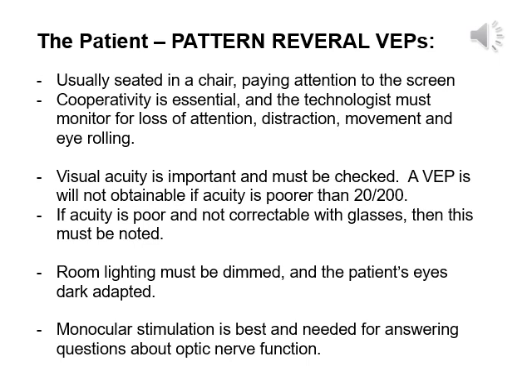If the acuity is poor, it would be ideal to correct the vision with glasses, and so patients should be encouraged to bring and to wear their glasses. If this is not doable, and the acuity is better than 20/200, then the test can be conducted, but this must be noted for the reader.